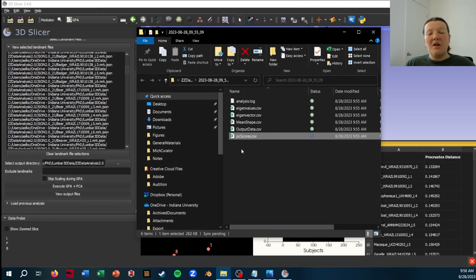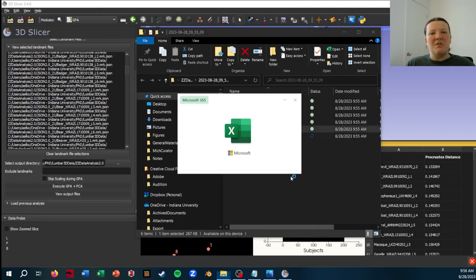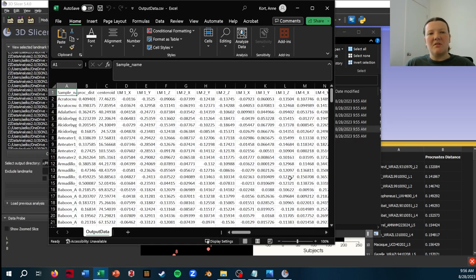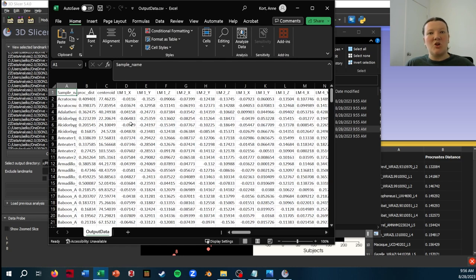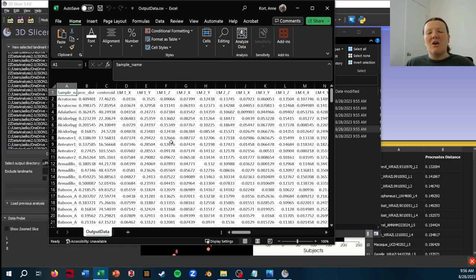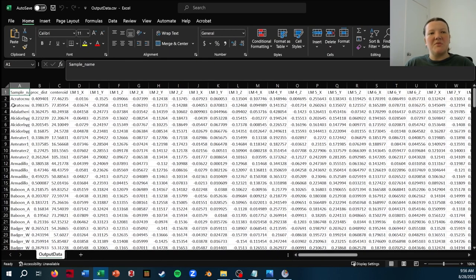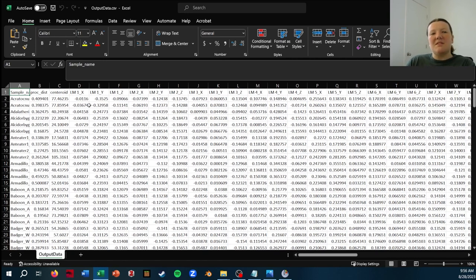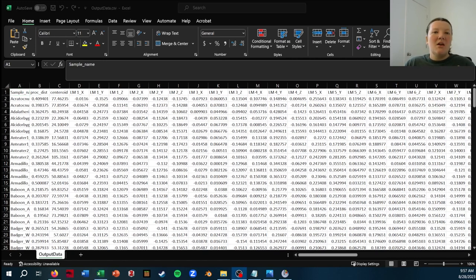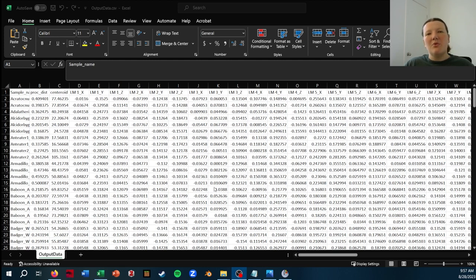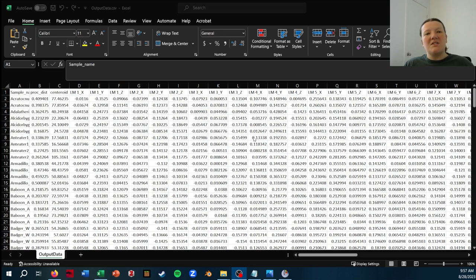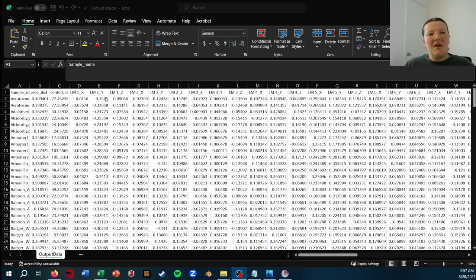But it will also give you the Procrustes landmarks if you want to be doing all of your statistical analysis in a separate program. And what's really nice about this is it's essentially formatted for the geomorph package in R, except that your Procrustes analysis is already done, which is really nice.